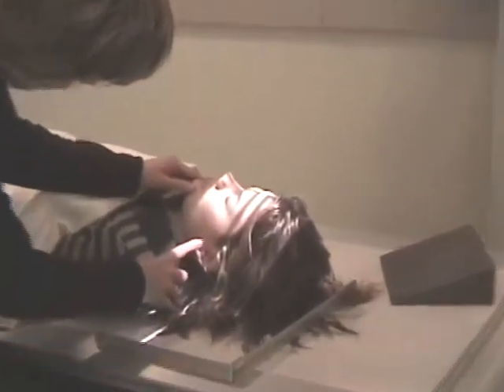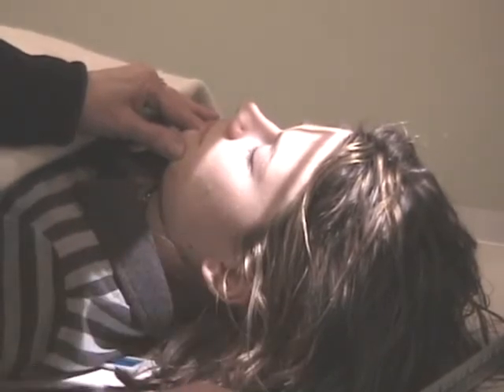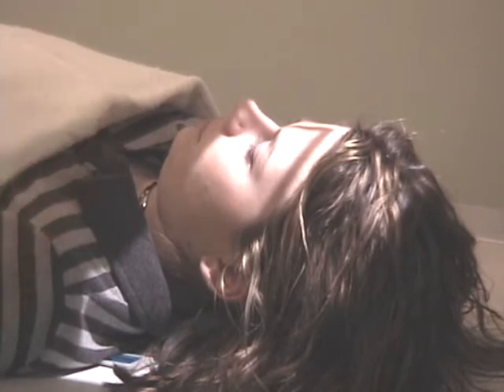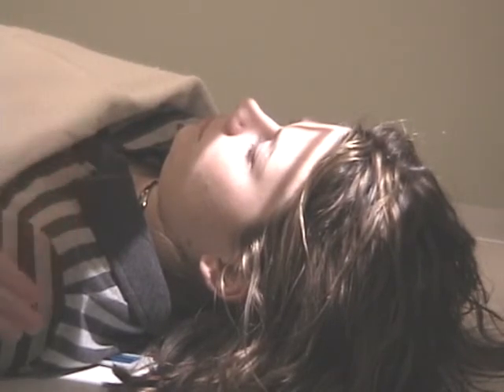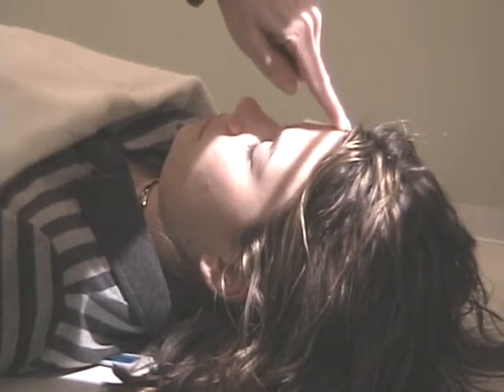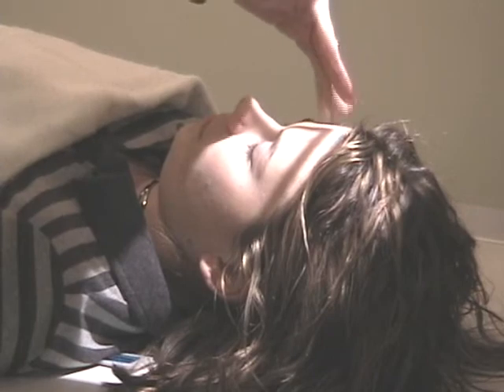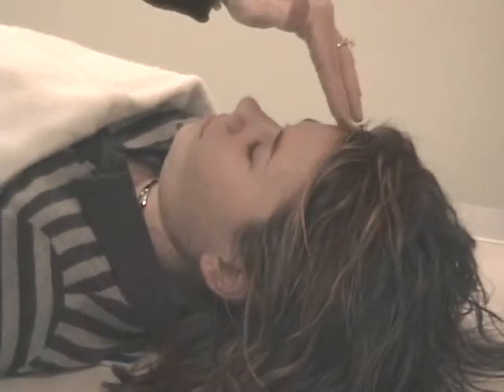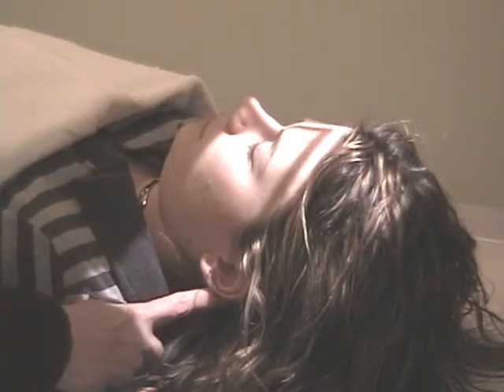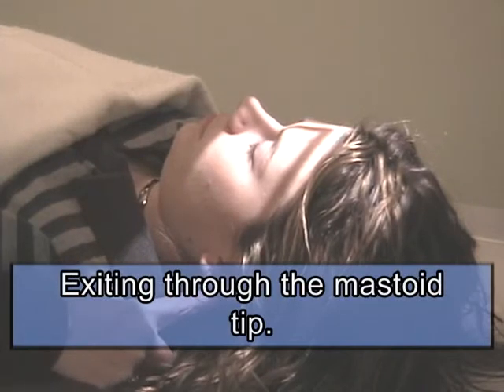I want my orbital meatal line perpendicular so my patient tucks her chin. Again, use the tricks if you need to with calipers. The gauge says 34, but it's actually 40 inches SID. I enter at approximately the level of the hairline. Remember, everybody has different hairlines. So it's approximately at the hairline. More importantly, I'm exiting through the mastoid tip. Central ray is at an angle, and I'm exiting through the mastoid tip.